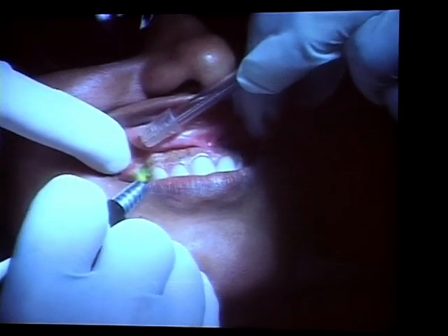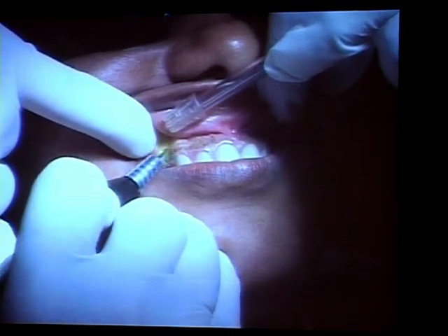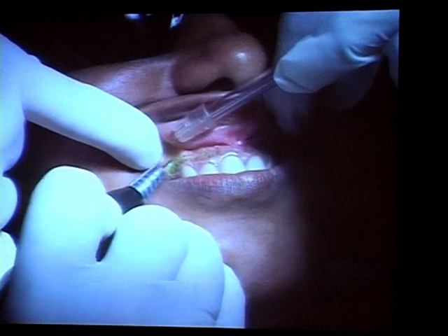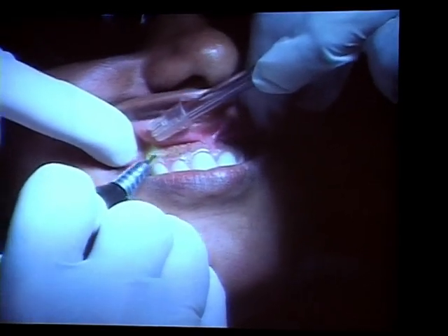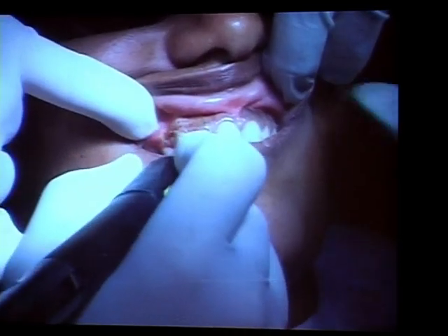All surgical procedures are in contact. The soft tissue modes will always be. Non-contact is only for low-level laser therapy, and endodontics and periodontics.